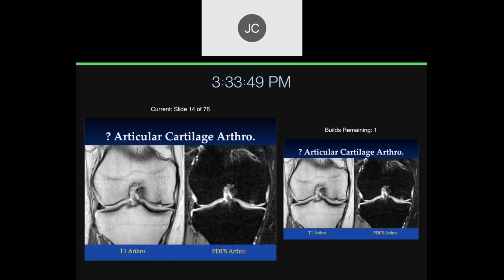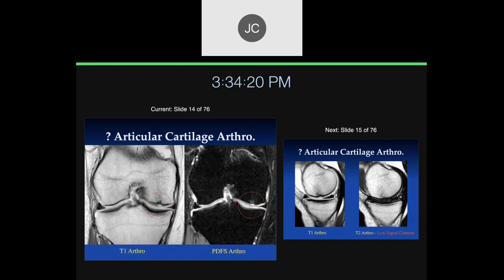Robert, what do you think of this case? We have T1 and PD fat sat coronals of the knee. This is another arthrogram. Laterally there's a little bit of blunting of the free edge of the meniscus. What we're worried about is what's happening with the cartilage — it looks like there's some chondromalacia there, grade four, meaning full-thickness cartilage loss with underlying reactive change.